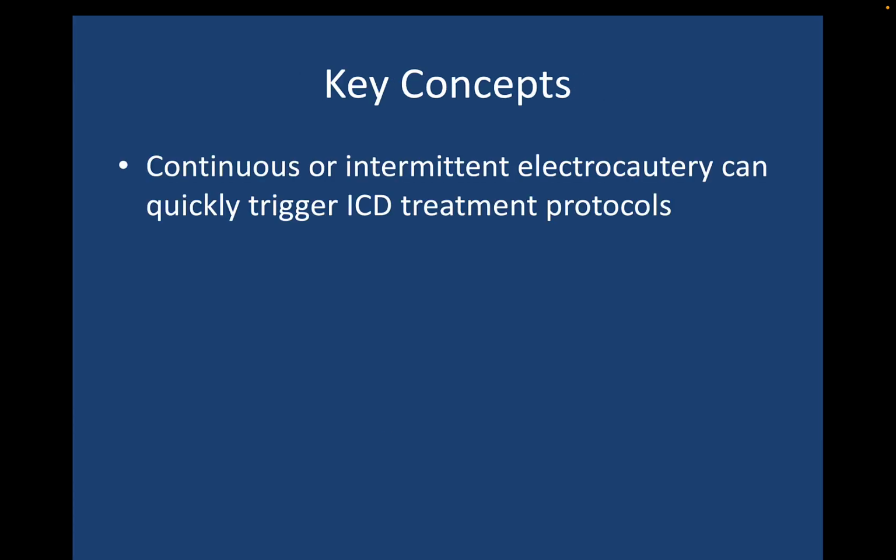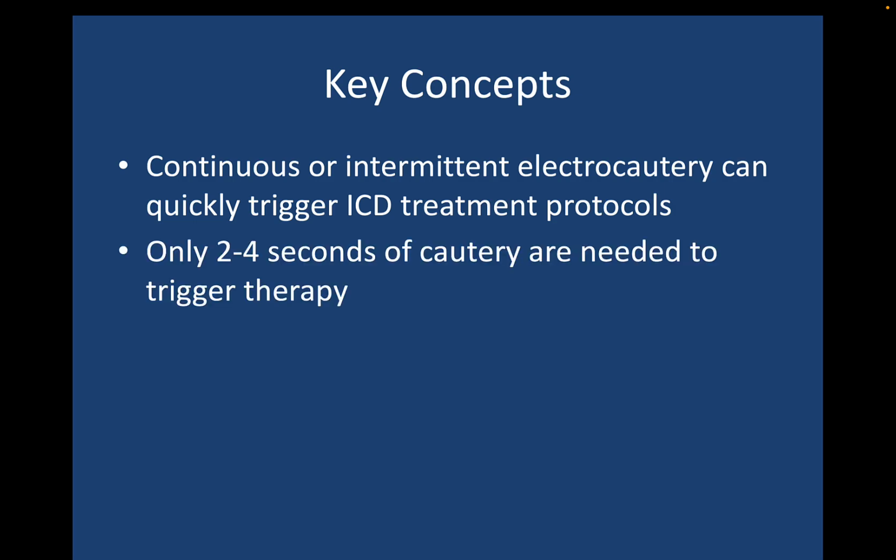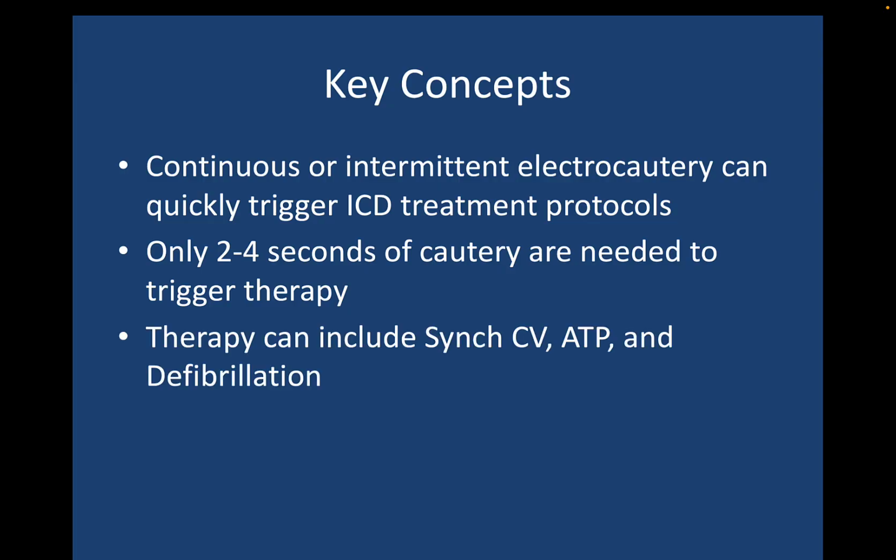So what are the key concepts to take home from these few examples? Continuous or intermittent electrocautery can quickly trigger ICD treatment protocols. Only 2 to 4 seconds of cautery are needed to trigger therapy, and therapy can include cardioversion, ATP, and defibrillation.